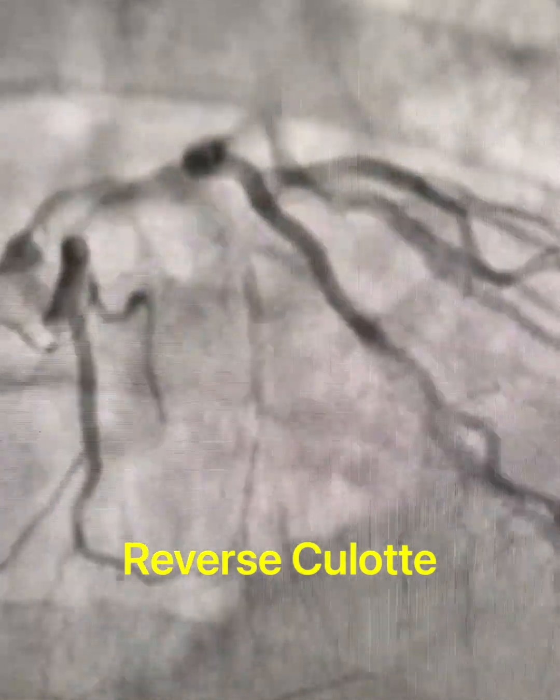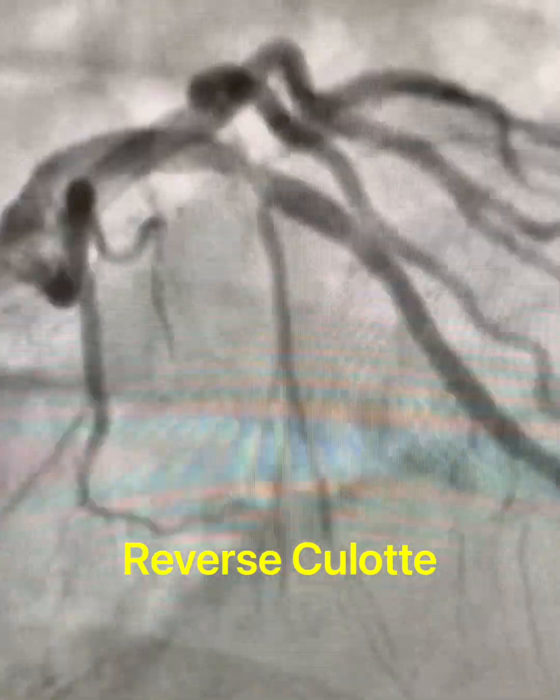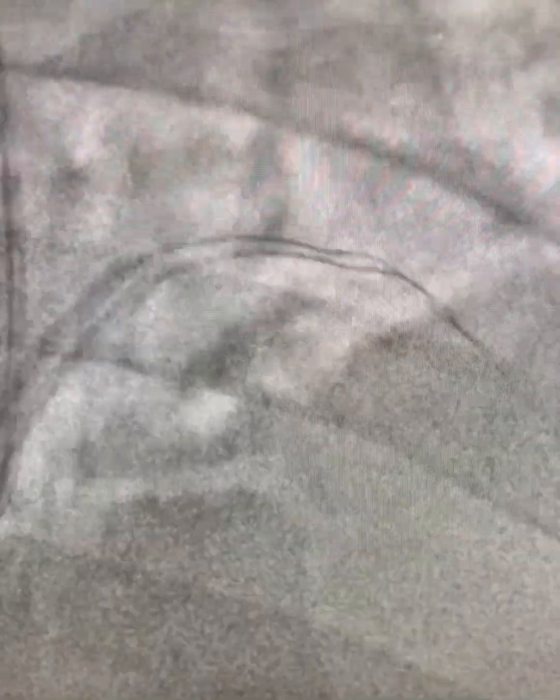This is a case of a Medina class 111 LAD diagonal bifurcation lesion, which we picked a reverse culotte given the size and the caliber and the severity of the branch disease.